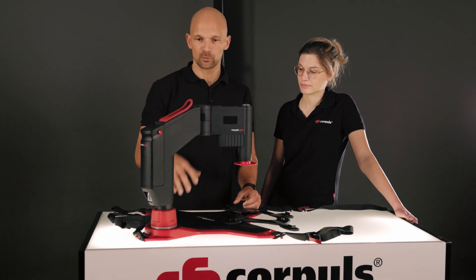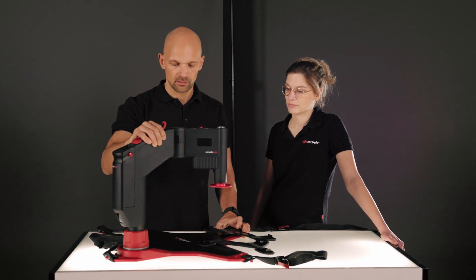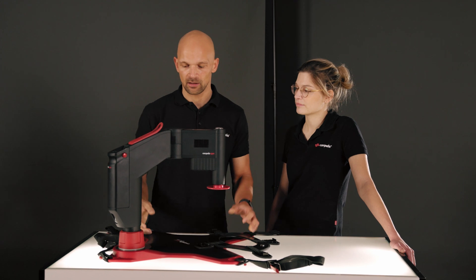In principle, when the patient is fixed on the corpuls cpr, they can be moved in all directions and the boards can also be used as a lifting aid.